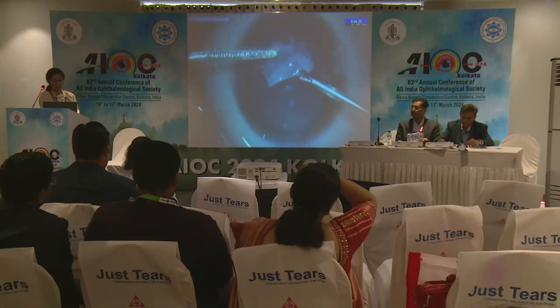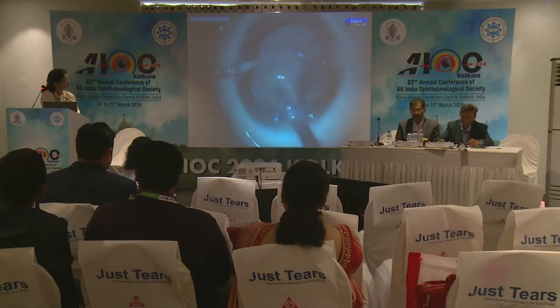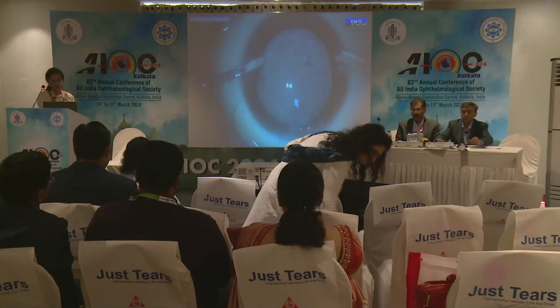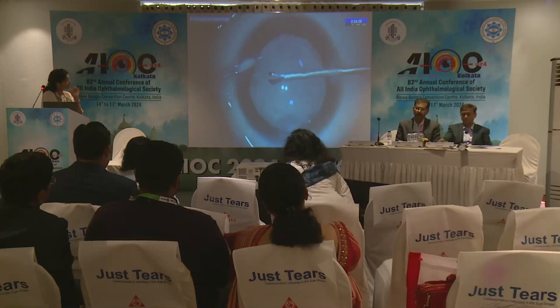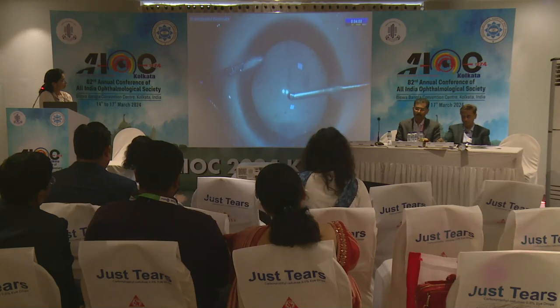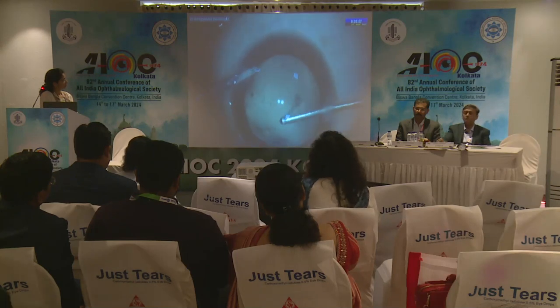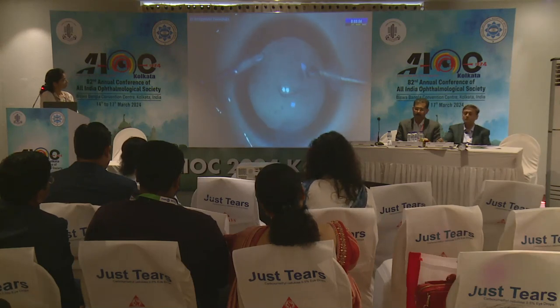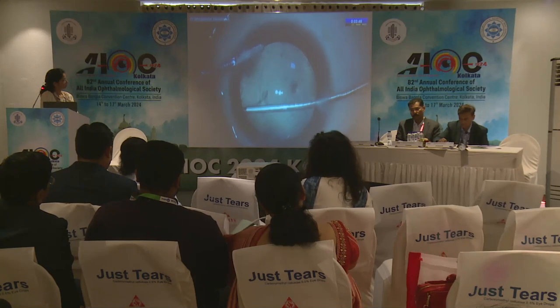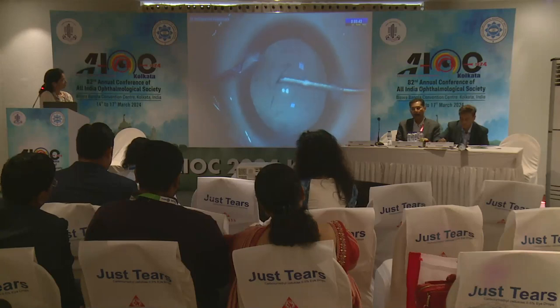Now it's time to assess my capsulorhexis. It's small, around 3.5 to 4 millimeters, and I definitely need to enlarge it. I'm giving a tangential nick with scissors and enlarging the capsulorhexis with microcapsular forceps. The final capsulorhexis turns out to be a bit larger than I would like to have. It's around 5.5 to 6 mm in size.